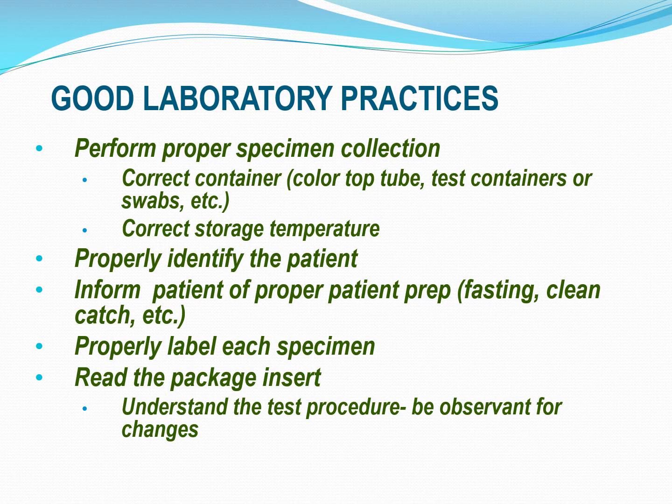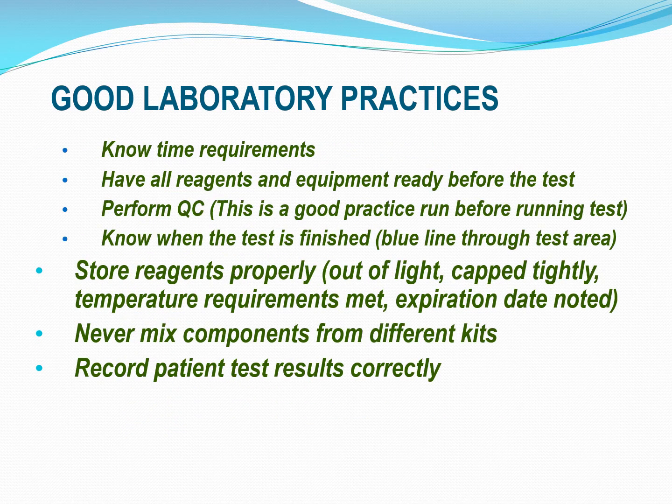When you're reading that package insert for each one of your kits, you want to make sure you understand the test procedure. Be observant for changes, like I said, because they do make minor changes from kit to kit. Make sure you know your time requirements before you get started, because sometimes if you collect your specimen and then you're not aware that the very first thing needs to be done within a few seconds, and you don't have your stuff out, it could cause you to have to go back and swab that patient's throat again or anything. So make sure you read over it, you know all the time requirements, and you have all your reagents and equipment ready to go before you test.